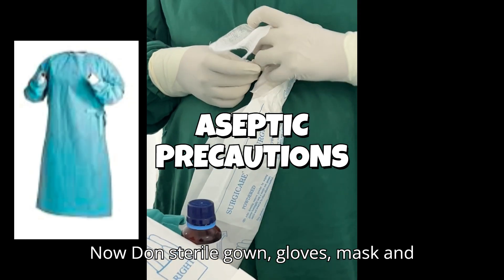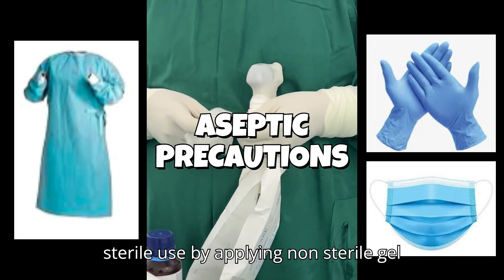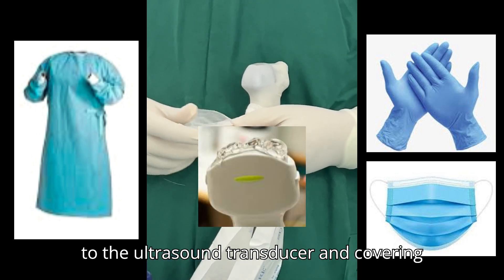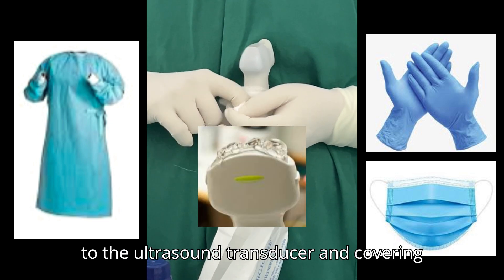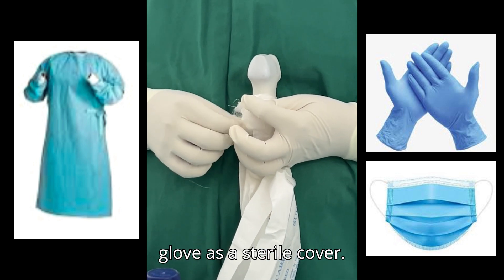Don sterile gown, gloves, mask and hair cover, and prepare the ultrasound for sterile use by applying non-sterile gel to the ultrasound transducer and covering it with a sterile cover. Here a glove is used as the sterile cover.